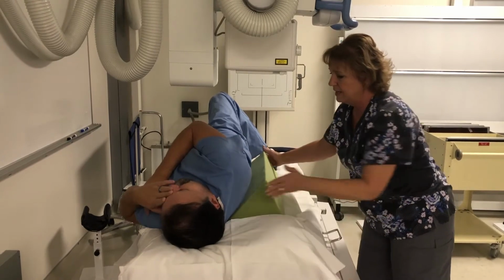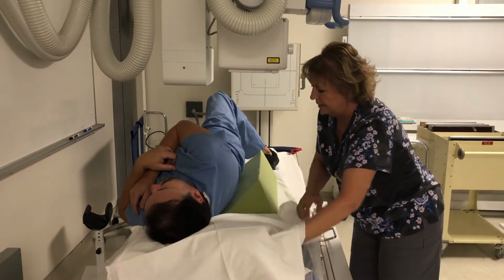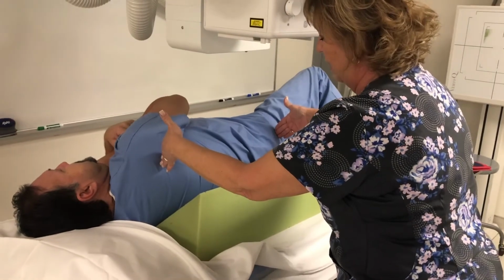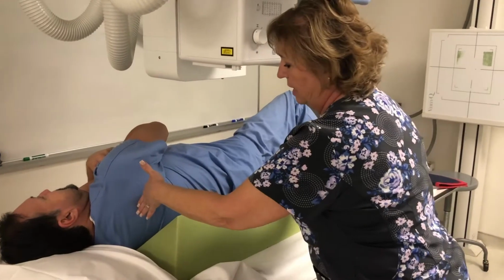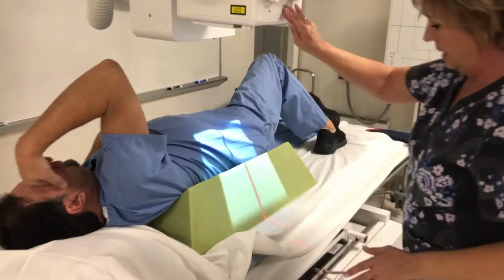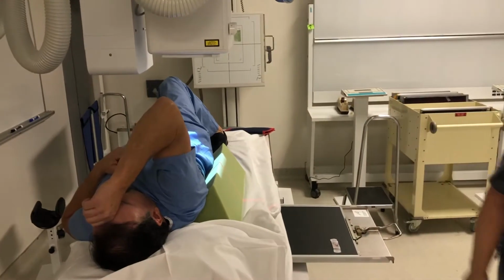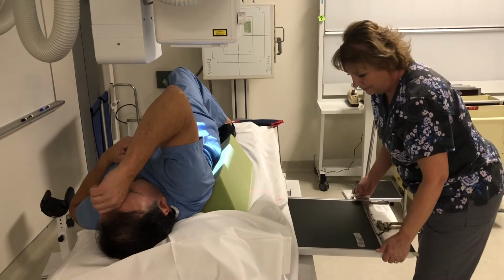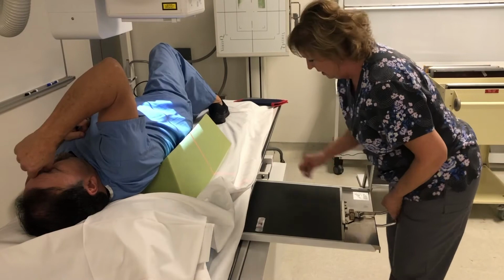And I'm positioning this so that it's halfway between, I have to move the pellet a little bit. It's supporting most of his torso and his pelvis. If you get it too low, when they lay back, their shoulders are rolled back. So I want to get this at least up to the level of his scapula. Okay, I've swapped out my 14 by 17 this time. Because I'm doing an LPO, I'm going to now put my left marker on, so I'm just gauging how far in I was before.